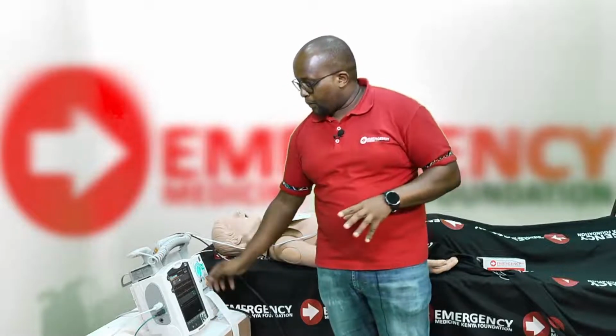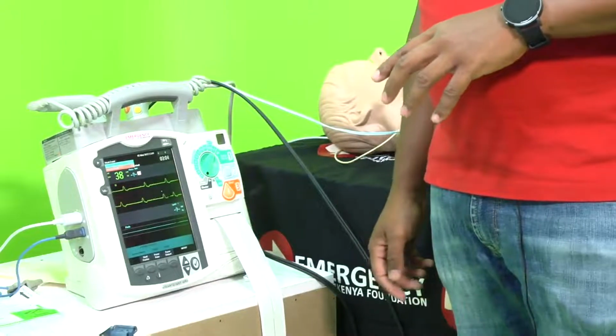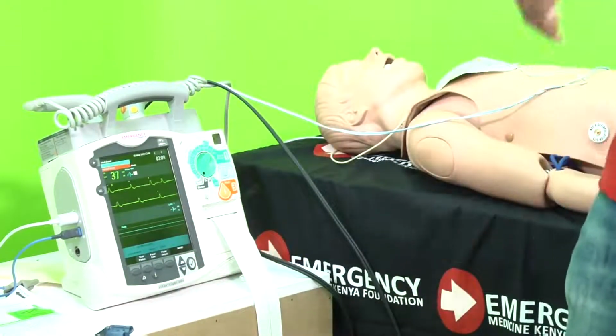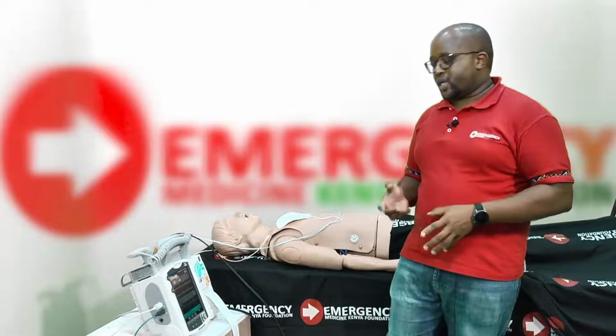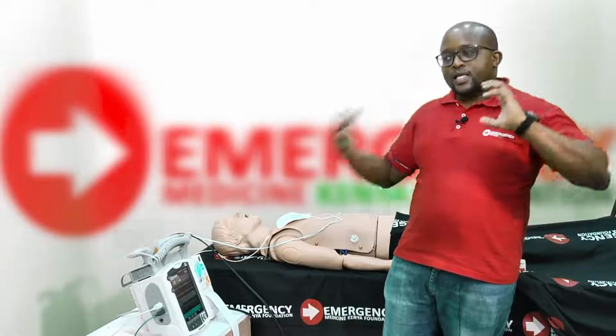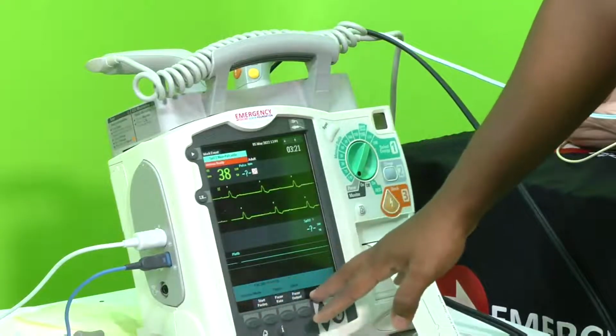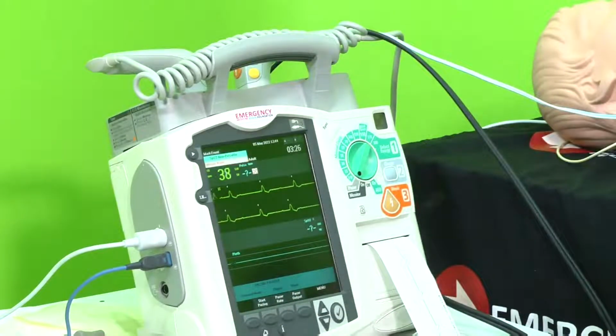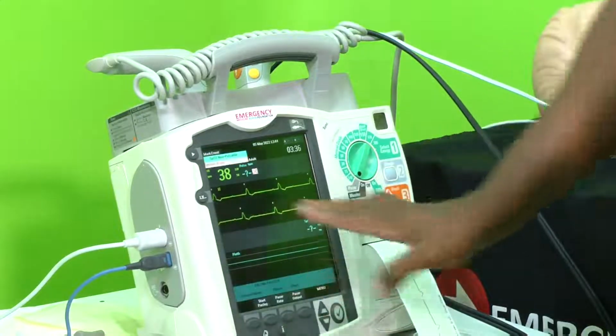A whole new menu will appear on the screen. So I've switched on pacer and I have a whole new menu that has shown up. Now, it's rare, we don't pace patients that much in the emergency care setting, and we tend to forget how to pace. The easiest way to remember is ideally you will follow the buttons as they are arranged on the screen or on your machine. But again, as I said, always just quickly get the algorithms out or the casualty app out. The procedure is well explained in the two areas. So I will just follow my buttons as they are arranged.